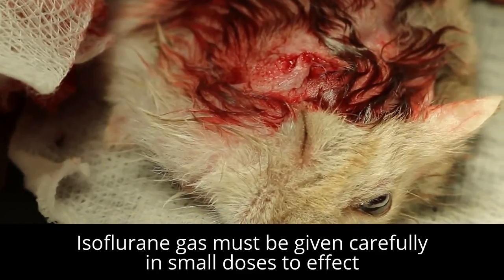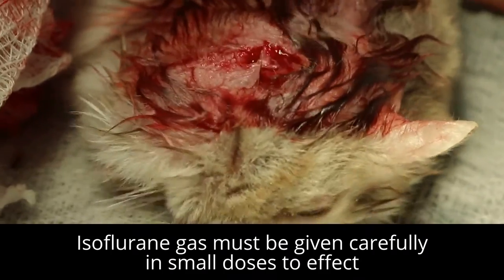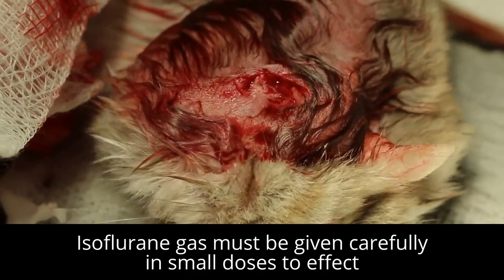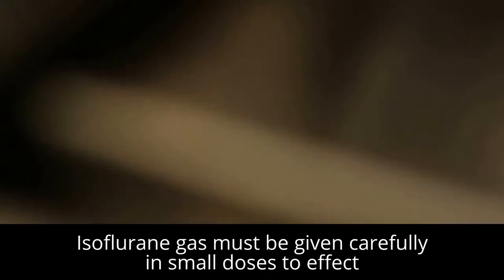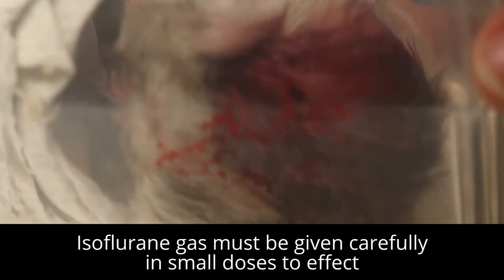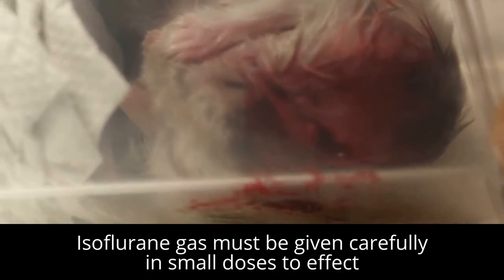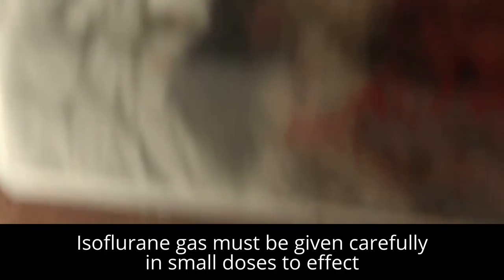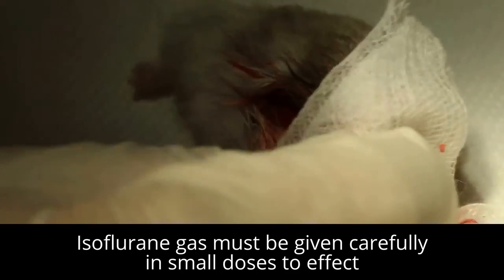So the hamster is still sleeping, so I can start to stitch on it. Okay, put it back, and then take it. Once you wake up, we just put it in again. Less than a few seconds, not too long. So make sure you have enough, of course. Few seconds. Just put it back here again. Then try and wipe away the blood. Wet this, then wipe away the blood.